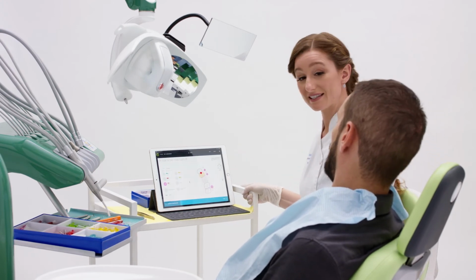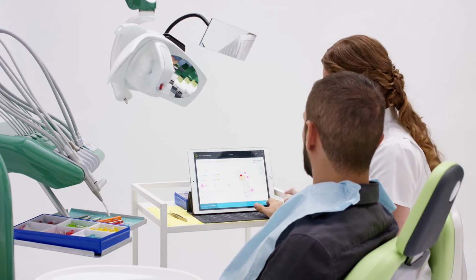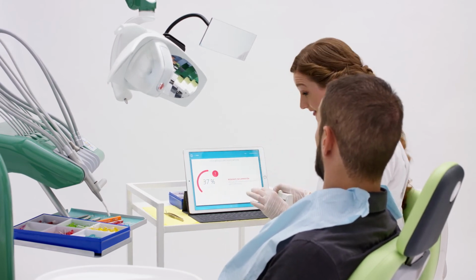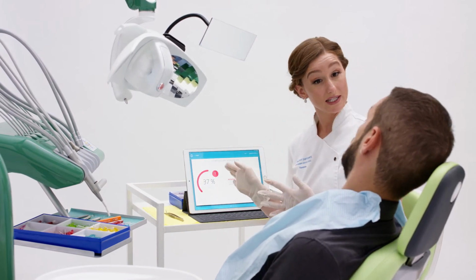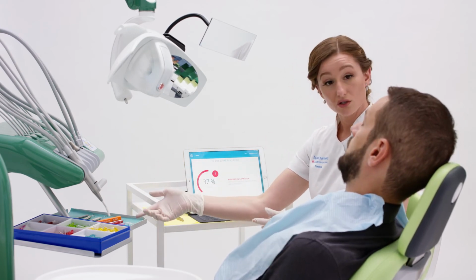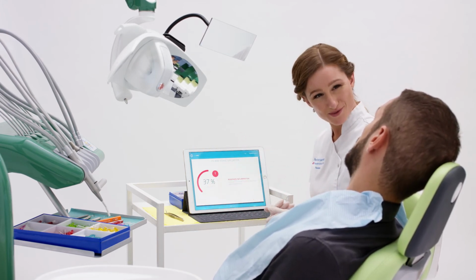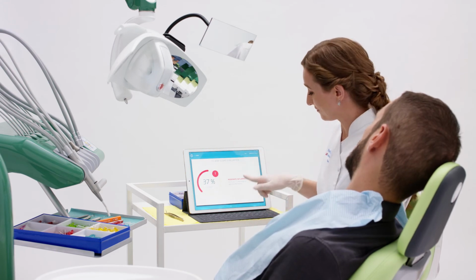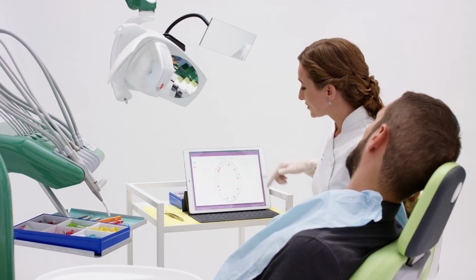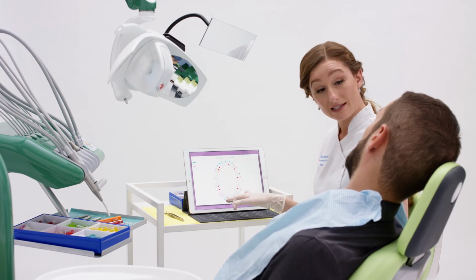I remove Edward's mouth map and ask him to now click the finish button so that he takes ownership of his own health. Once the finish button has been clicked, the Bob score is completed and Edward receives his overall Bob score, which I discuss and explain further. Edward now understands the importance of cleaning interdentally daily and feels motivated and supported to do so. I then show Edward where we would view his past and present Bob scores. His full mouth map is also viewable to take a final review and remind him that this is the image he can use at home to support him in using his interdental aids.